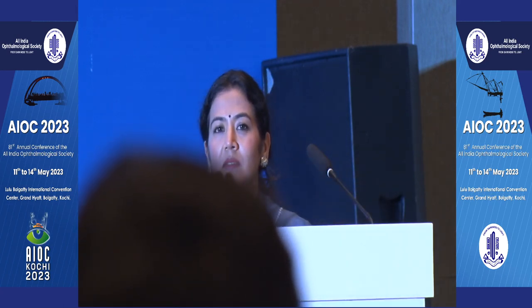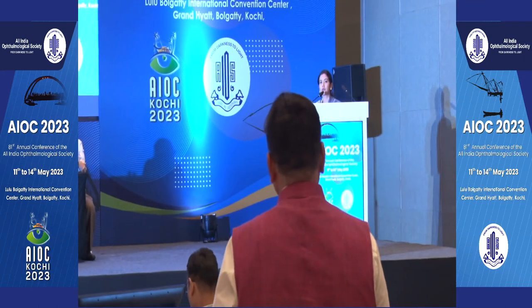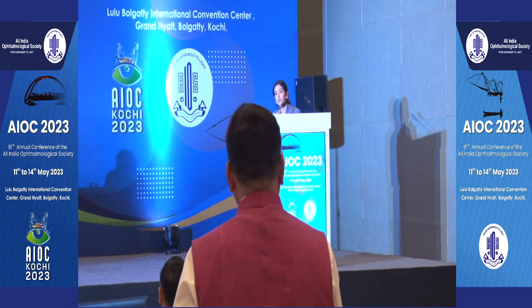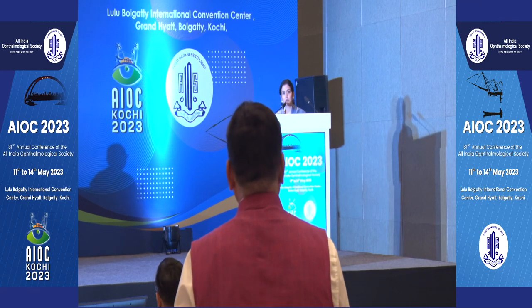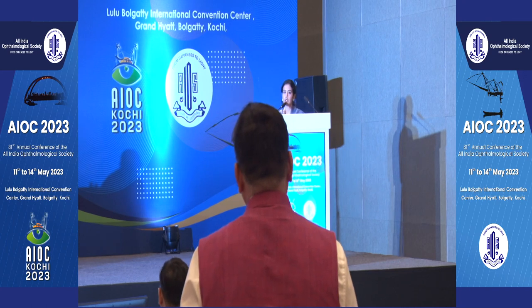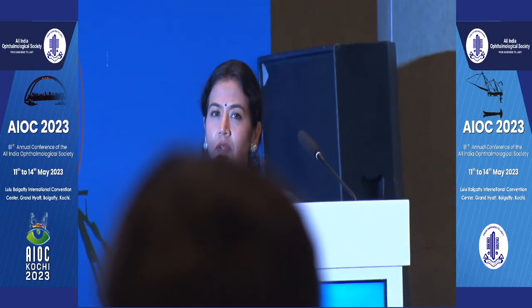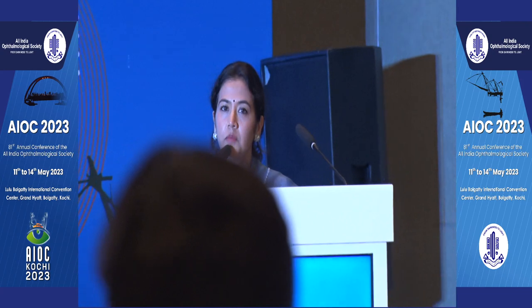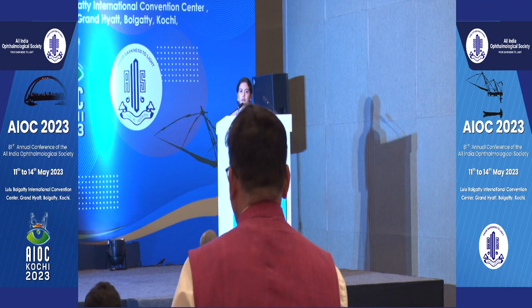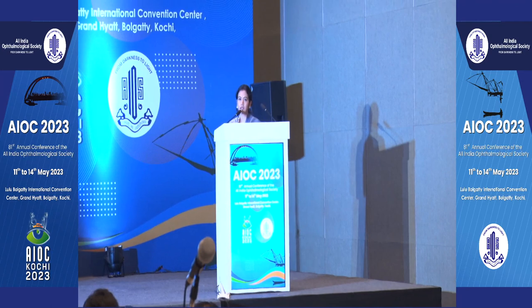In vitrectomy surgery for PHPV, what are the chances of vitreous hemorrhage and how do you tackle it there? So you have to cauterize it well. Make sure that every vascular tuft that you see, the feeder vessel, is cauterized. With a well-done cautery, and not cutting beyond the cauterized edge, you can try and prevent it. But there are times when you've had a bleed and you've had to use PFCL and increase the intraocular pressure.